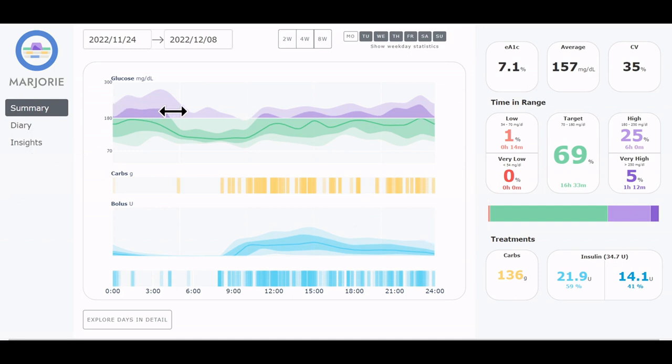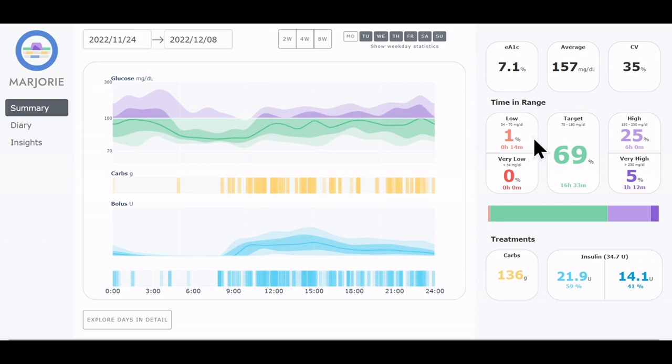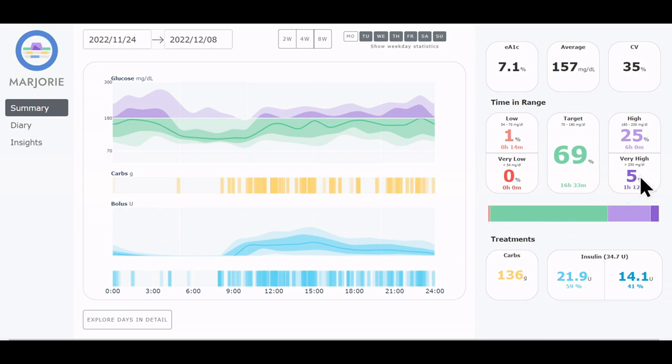The graph shows the ambulatory glucose profile, which is a visualization commonly used for diabetes data. It's an aggregation of multiple weeks of data over 24 hours. The sidebar on the right shows relevant statistics for this time frame, and we see that the patient generally has a good time in range of about 70% here in green, but has a problem with high glucose values highlighted in purple.